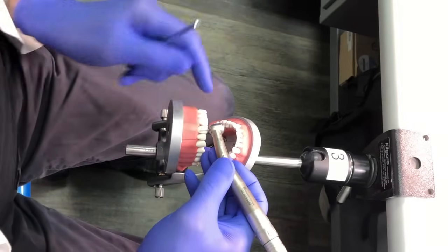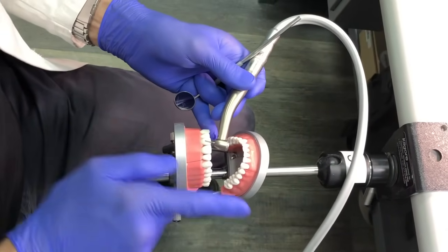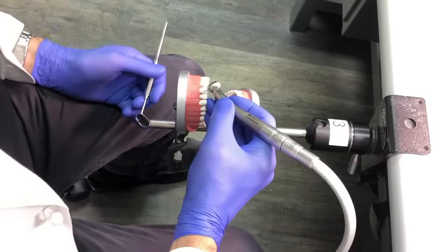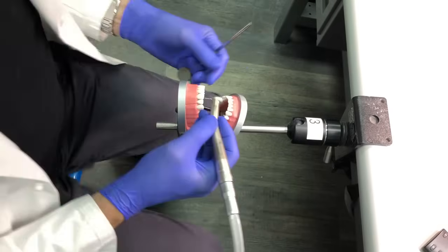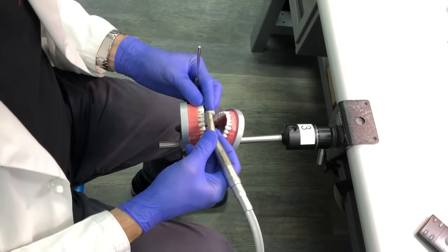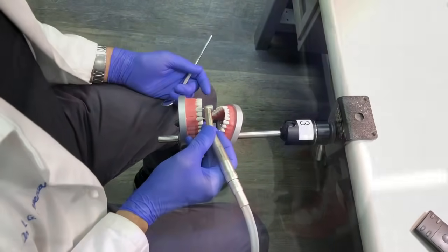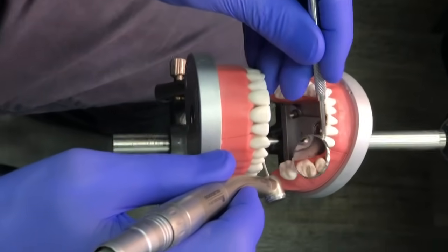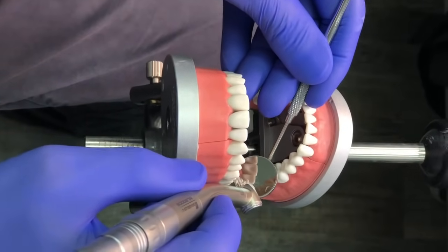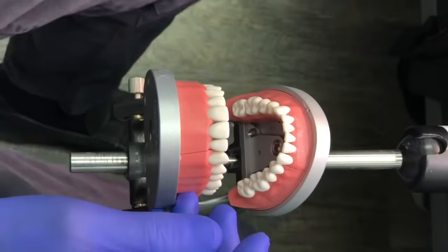A common problem with right-handed operators is that anterior teeth get prepped leaning toward the left; for left-handed operators, toward the right. This happens because the handpiece is held upward without locking into the line of draw. You have to look at the patient straight on, identify the line of draw for that tooth, lock in, and then if you move slightly your wrist will maintain that line. Sometimes the mirror floats above the handpiece, and other times it should be positioned behind or in front — those are other variables to try.